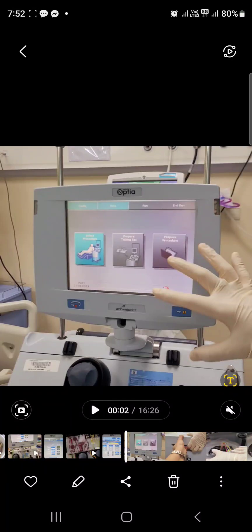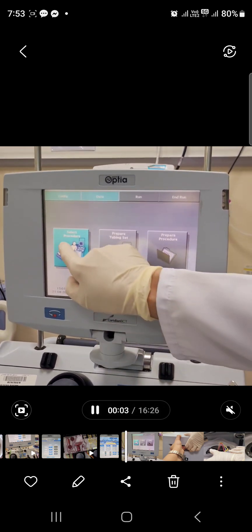I want to share how to set up the Optia machine, which we use for our patient in CCU/CCBet 2 on plasma exchange, or what we call plasmapheresis. First and foremost, do not forget to turn on your machine, which is located on the right side bottom part of the machine. Turn it on. Once you turn it on, you are going to select procedure.